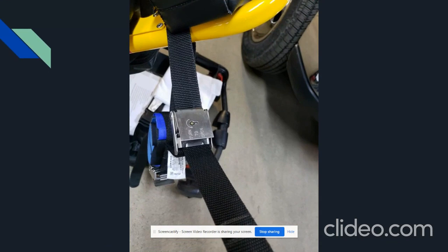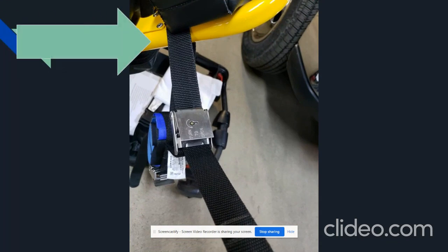And here is a picture just showing you that the restraint is attached to the metal frame. That is very important, to make sure that it is on the frame and not on any other moving part of the cot. And as you can see, that little metal piece locks onto the restraint. So after that is done, you cannot move that unless you take the key to unlock it. And then you can move it as you wish to.